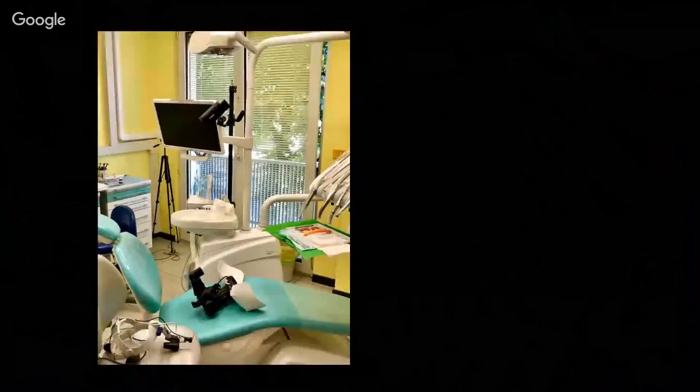So that's the dental office where I'm working most of the time. You can see how I work. I have one camera here, one screen with the intraoral camera here. Sometimes I need to put some pictures to guide me while working. And here you can see my loupes and my camera.